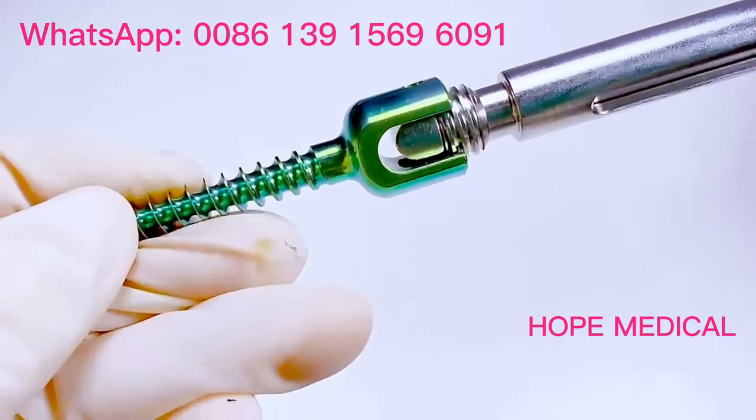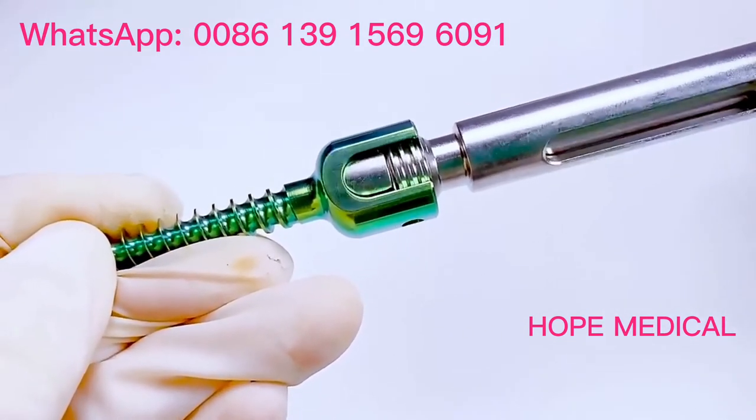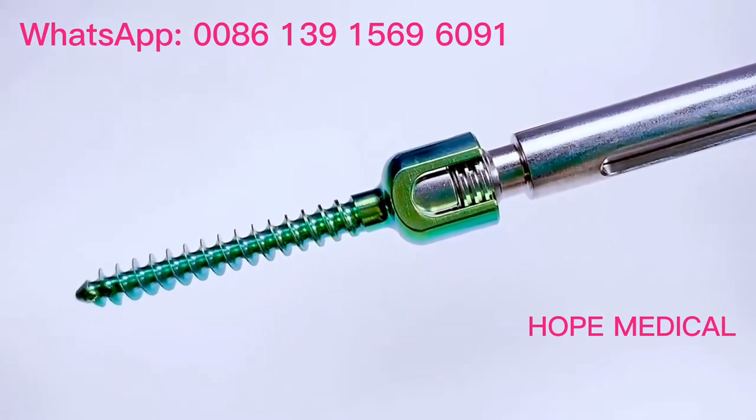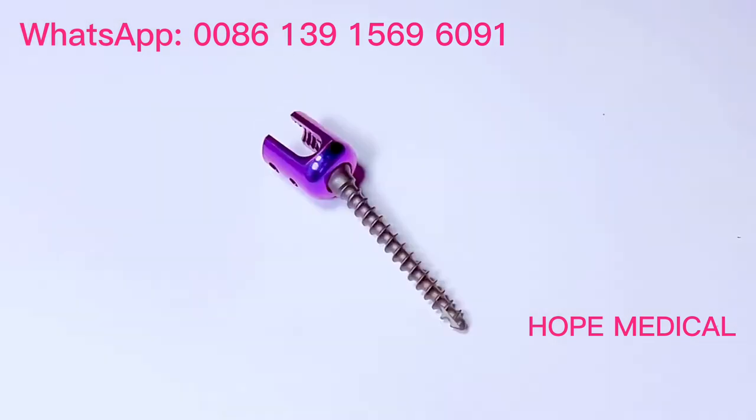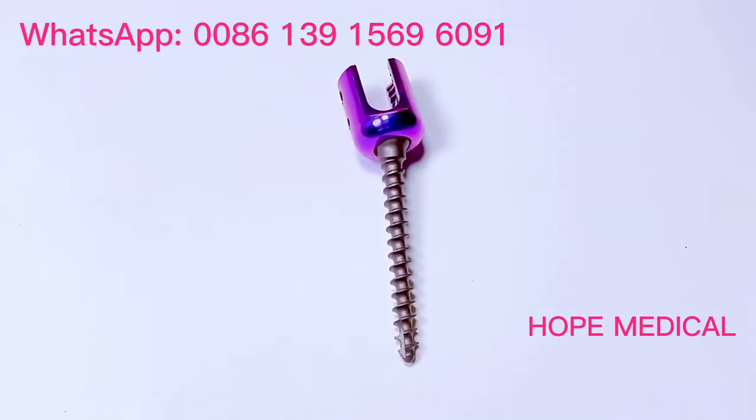In this system, we have 4 types of screw head: Mono Axle, Mono Axle Reduction, Poly Axle, and Poly Axle Reduction Screw. We have a full range of diameters starting at 4.5mm.